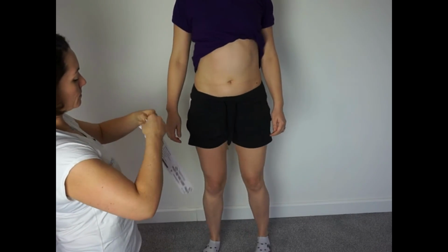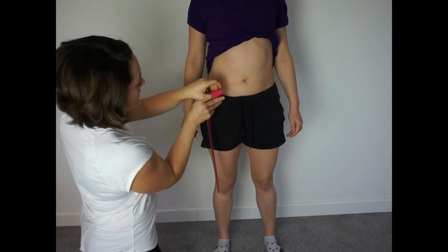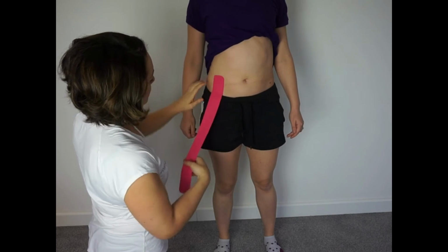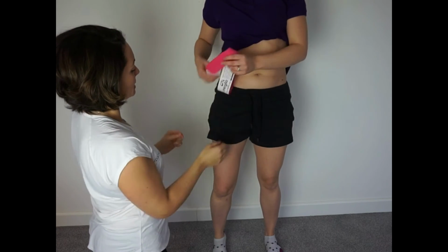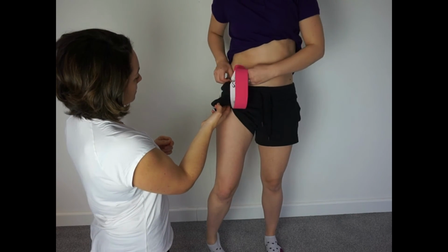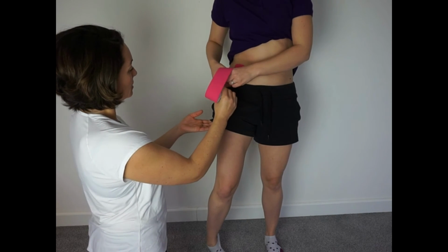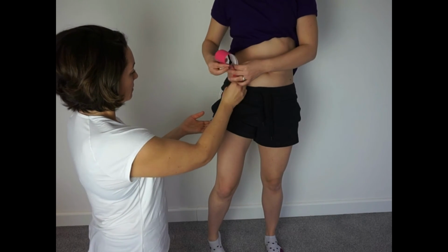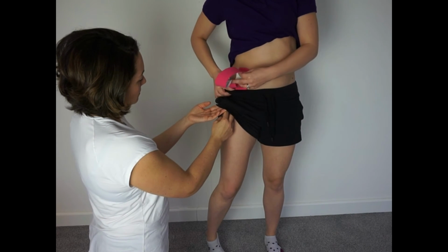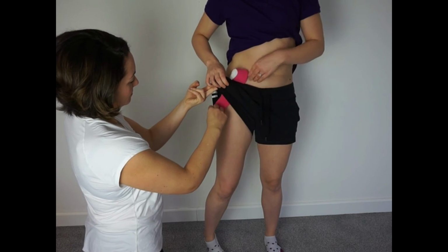So I'm going to anchor well above the front of the hip so that I can activate the whole length of the rectus femoris. So I'm anchoring here, no tension, no stretch. Now I need to feed this through the client's pants or shorts, so simply ask them to do it for you. Much simpler, they'll feel more comfortable, and you can ensure that you can get the tape where you need it to be. So they're going to feed it through. And you can just bring it through when they're ready.